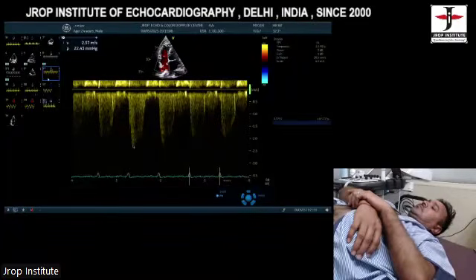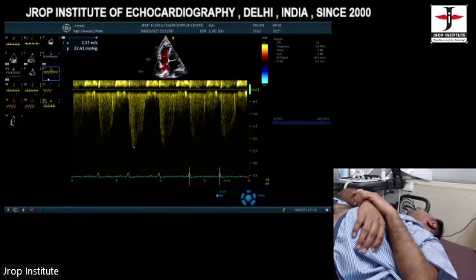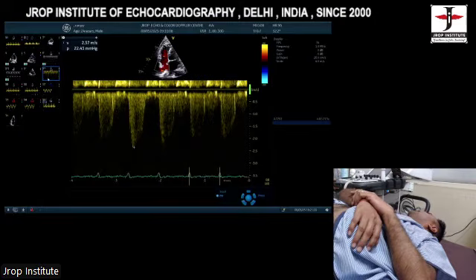So regarding LV measurement, what I see is the central part, the body of the LV is wider. Where we are measuring the LV is at the tip of the mitral valve, LV dimension. Correct. So should we correct?